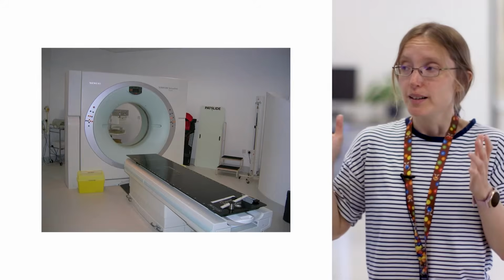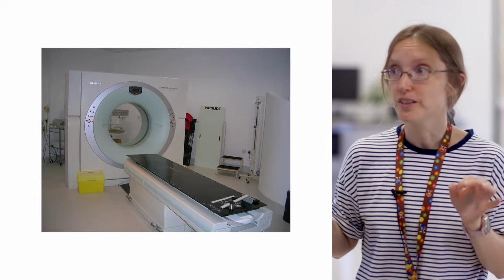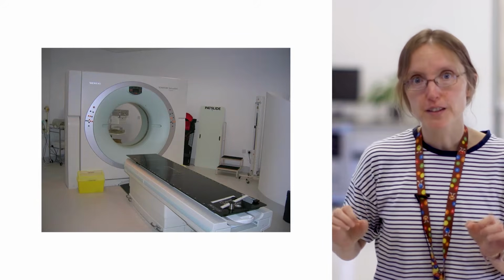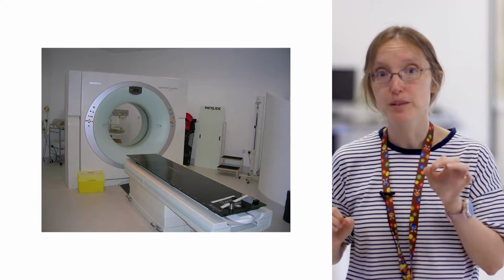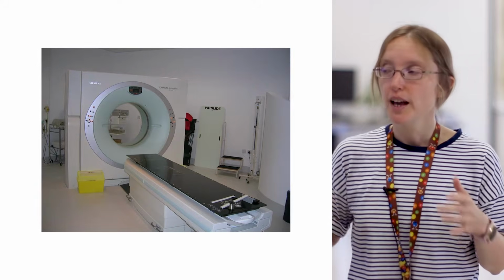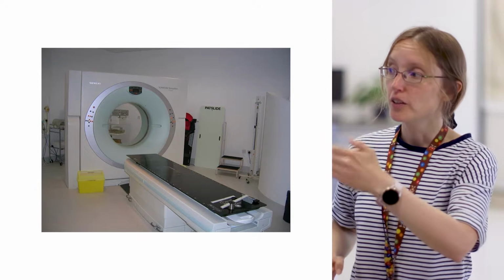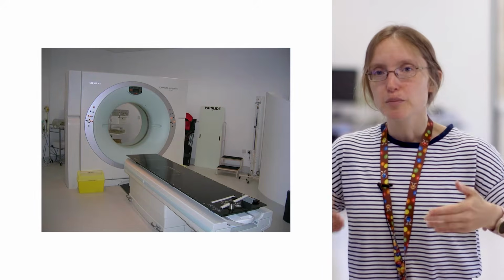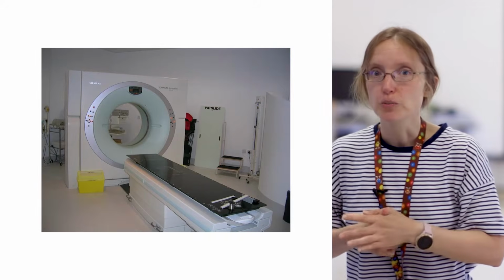This is a CT simulator, so this is just like a normal CT scan with a few important differences. First of all, the bed is hard and flat. Everything's to do with keeping the patient in the correct position and the same position for treatment to treatment. And so this is a hard bed, so they can't sink down and change their position. And also there are marks along the side of the bed so that we can always line the patient up with reference to these marks. Otherwise, it's very like a normal CT scanner.